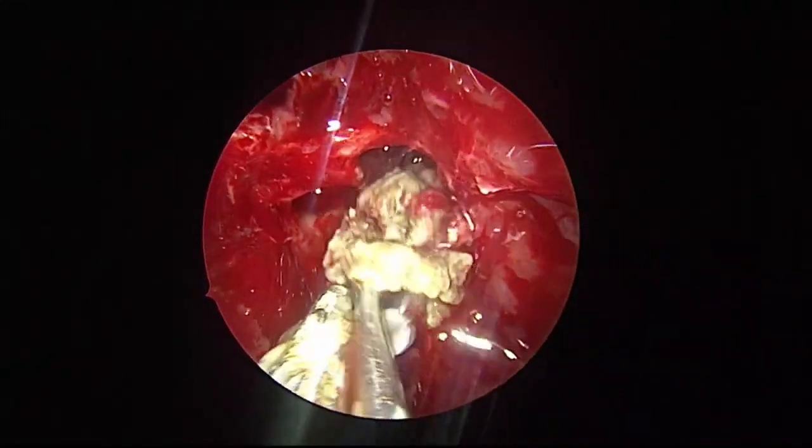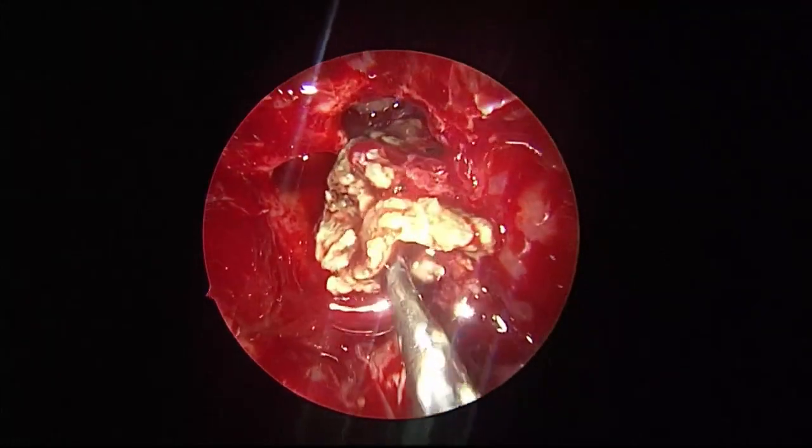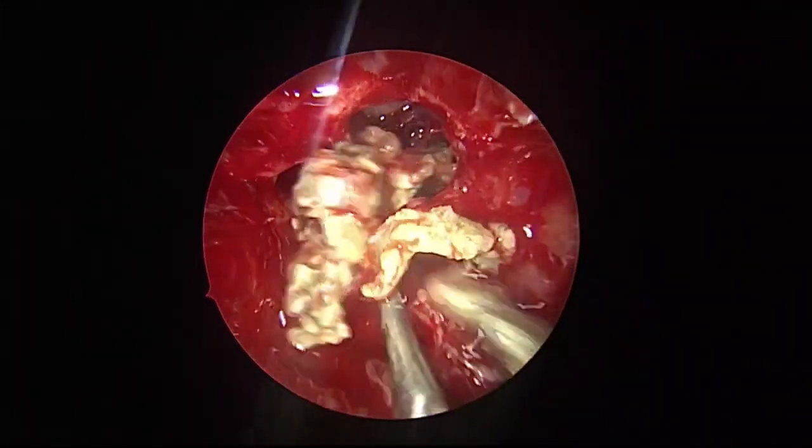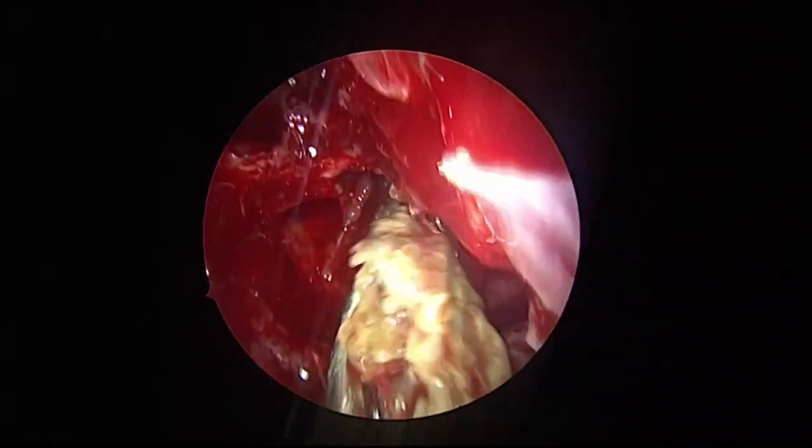The ball probe is a fantastic tool. Engage, dislodge, and a very, very blunt instrument. See this again, a big chunk.